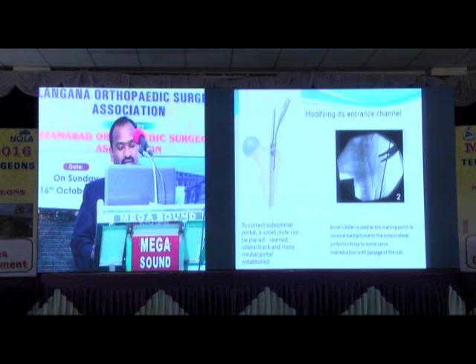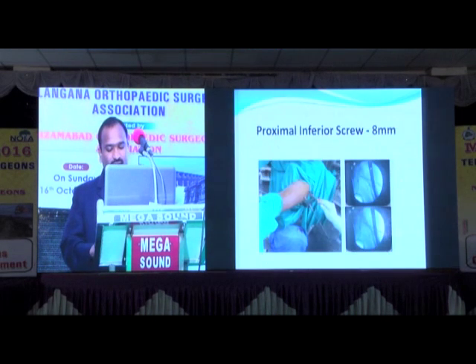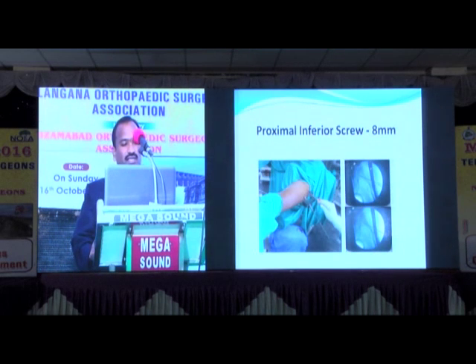If it is hitting the anterior cortex of the femur, the nail portal is wrong. If there is any difficulty in passing the nail or we are not able to correct the angulation, we can use two methods: blocking the lateral side with a one-third tubular plate or any plate, and making an entry medial to it. If these plates are not available, we will nibble the bone on the medial aspect and pass the K wires.